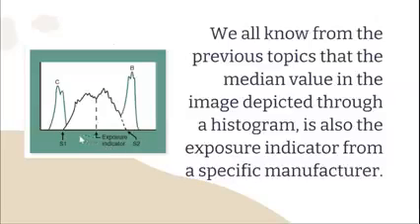And a range of acceptable exposure indicator values is framed around the center point for guidance to radiographers as to whether the radiographic technique fell within an acceptable range of exposures. Okay, so since lisod man kayo acquire ang thin line sa inyong median na exposure indicator, your manufacturer will set a scale, of course, from S1 to S2, including na sa exposure indicator, para ang aim ninyo is to provide an exposure to the patient within the acceptable range.